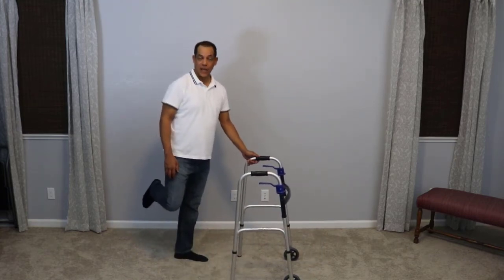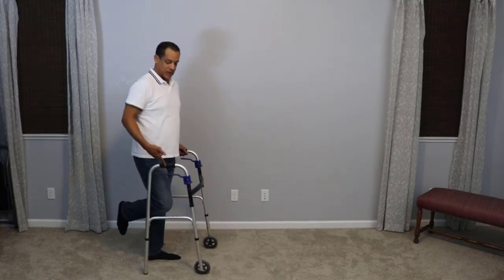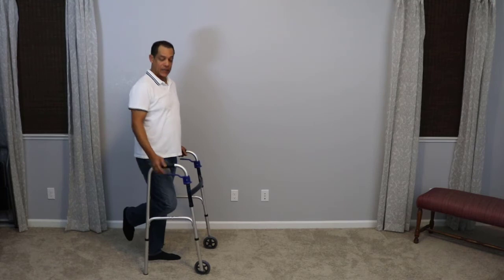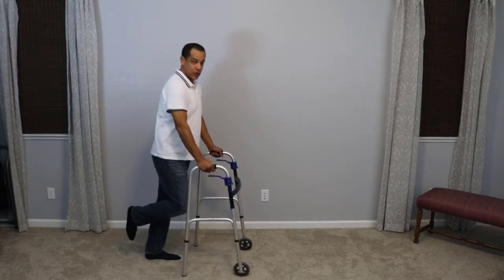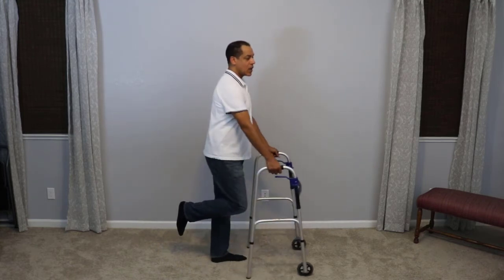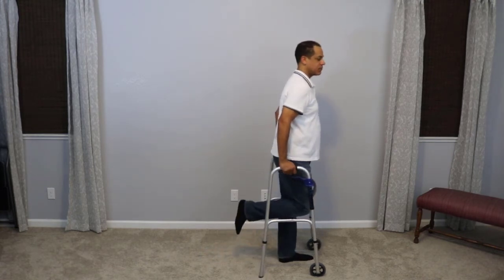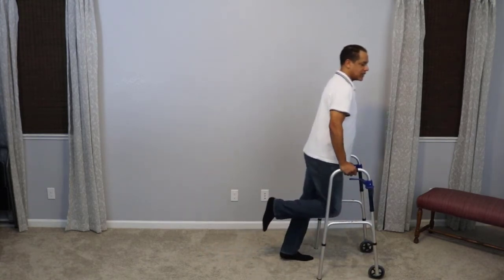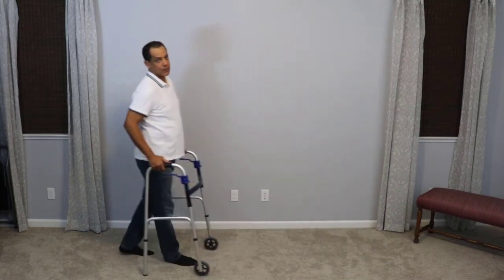Let's assume I'm not able to use my right leg, or I only have my left leg. When using the walker, I want to make sure it's adjusted to the right height — adjusted at the bend of where my wrist bends when I'm standing up straight. I would then advance the walker out, bear the weight on my arms, and take a step nice and easy. Advance the walker, bear the weight on my arms, lean on my arms, take a step, and take another step.